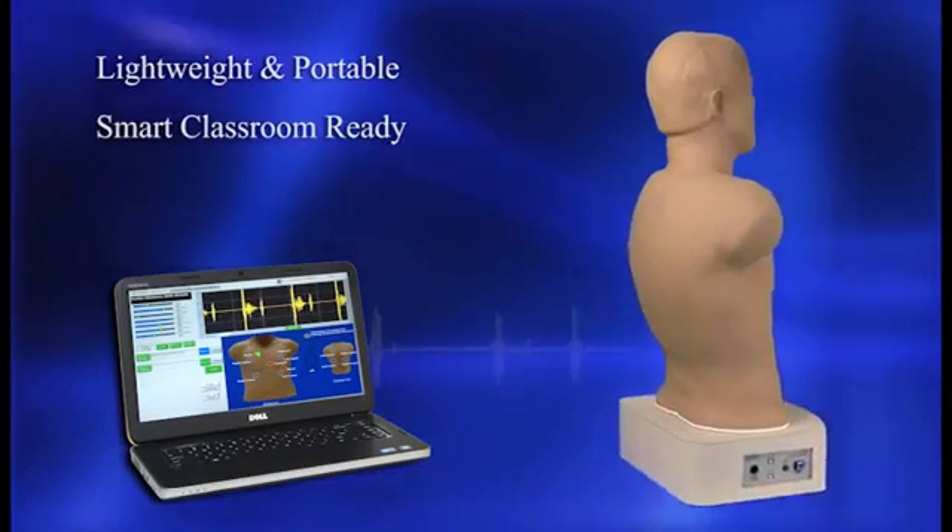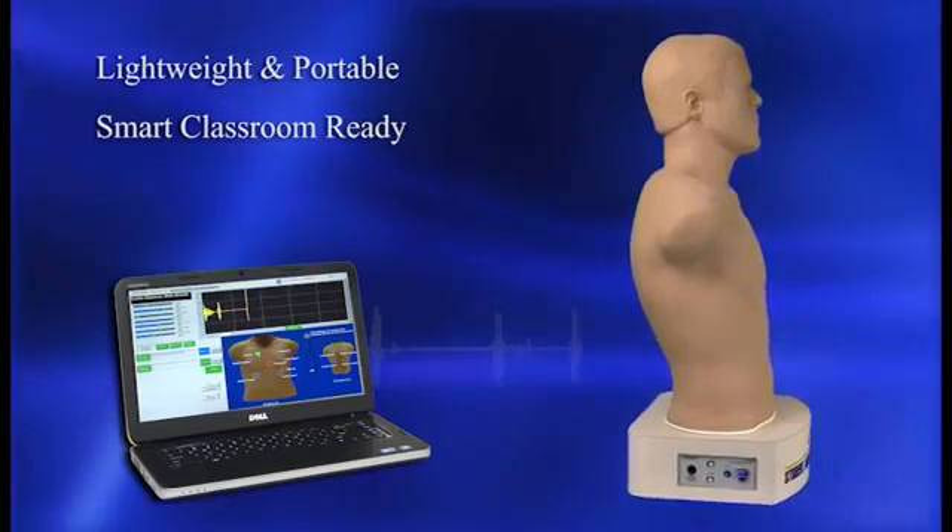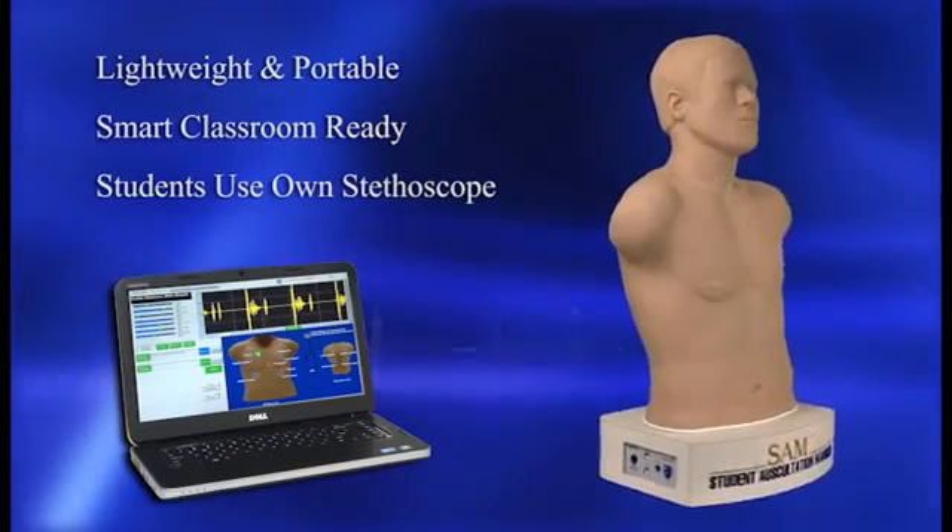Its software interface can be integrated with any smart classroom system, and students can use their own stethoscope.